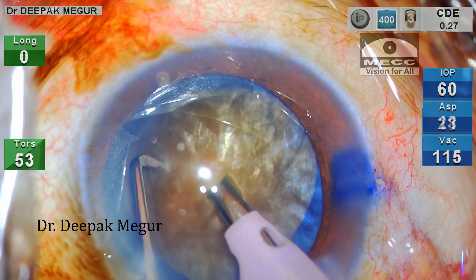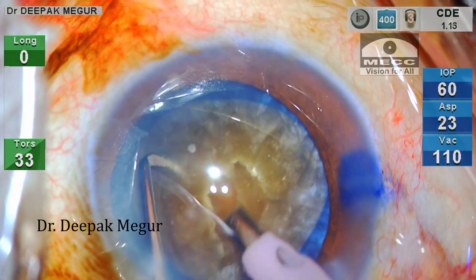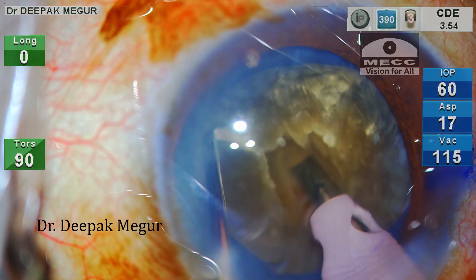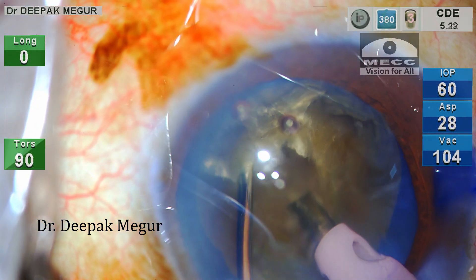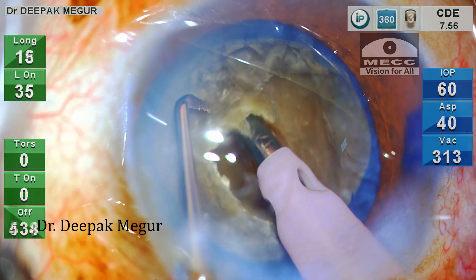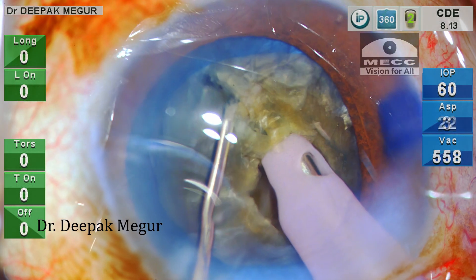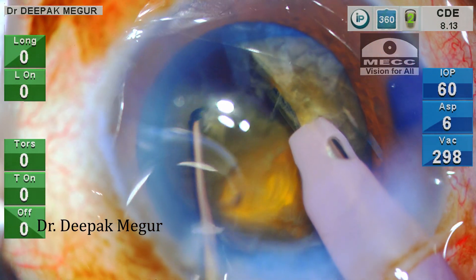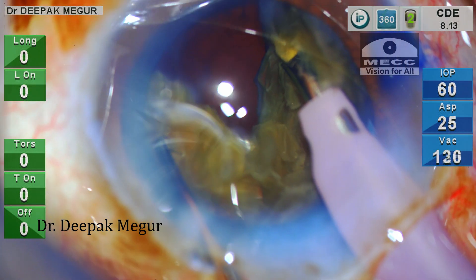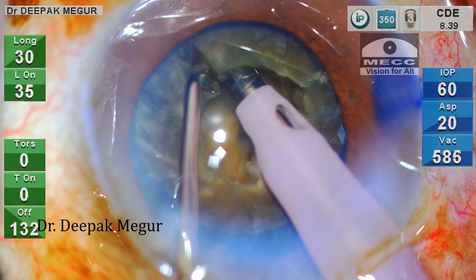My strategy for nucleus management is to create a deep trench in the central core of the nucleus and then perform vertical chop. While trenching, I am using my chopper to stabilize the nucleus. Once I sculpt it to about 70% of the depth of the nucleus, I change my settings to chop mode. The tip of the phaco needle is buried into the nucleus and then a sharp vertical chop is initiated. I need to repeat this maneuver of lateral separations at progressively deeper planes to achieve the posterior plate crack. The nucleus is rotated and the opposite end of the initial crack is completed.